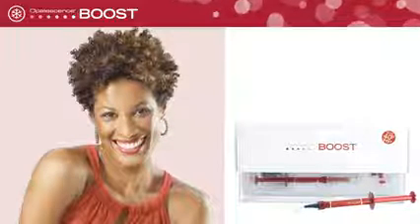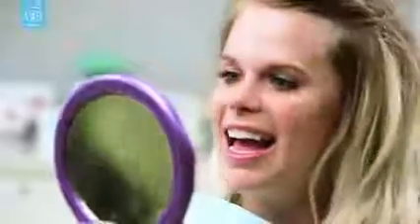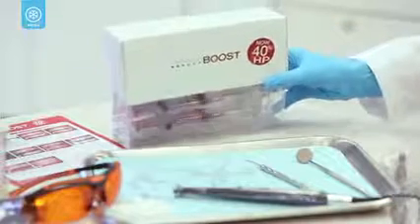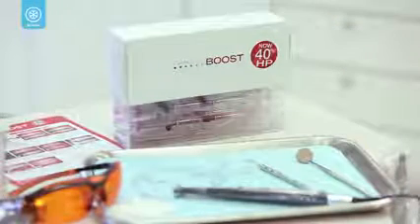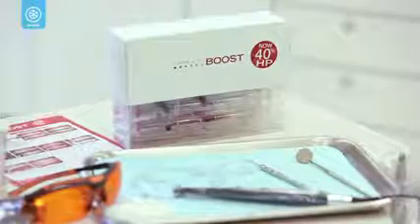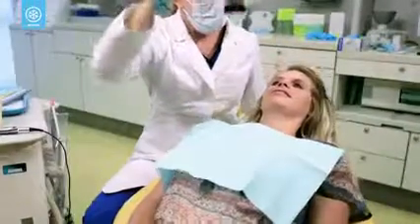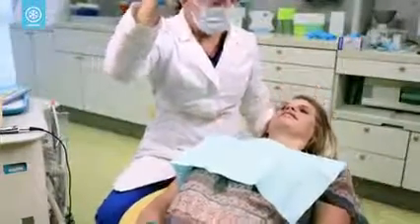Opalescence Boost is a powerful 40% hydrogen peroxide in-office whitening gel that can provide stunning results in as little as one hour. Because of its unique formulation, Opalescence Boost is able to provide impressive results without the need for lights or lasers that can dehydrate the teeth and cause sensitivity. In this video, we'll show you step-by-step how Opalescence Boost can brighten your smile.